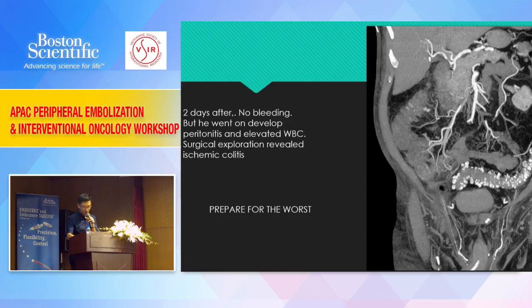So for the colon, we can occlude the perforating arteries with confidence. There's no ischemia, but sometimes we have to occlude the marginal artery, and that is quite dangerous.